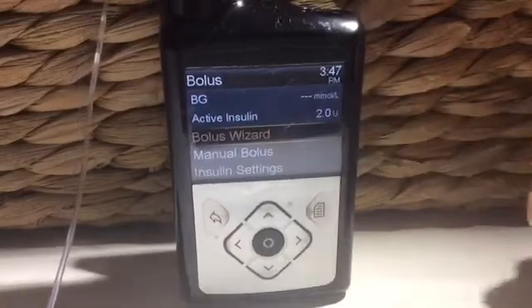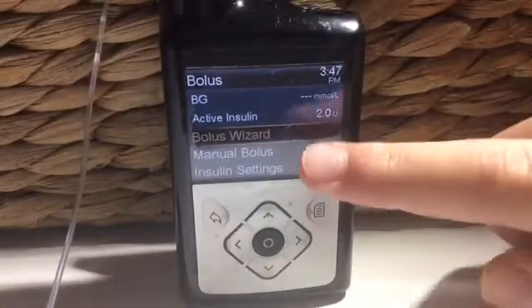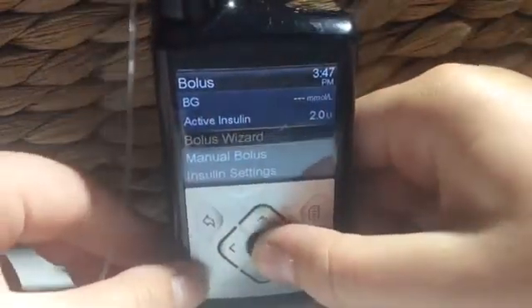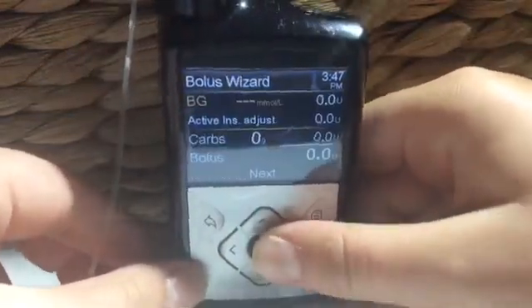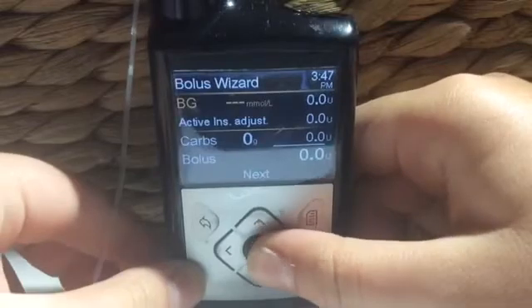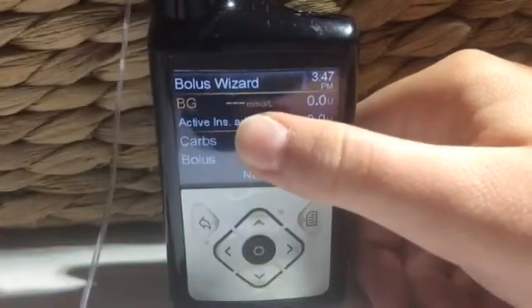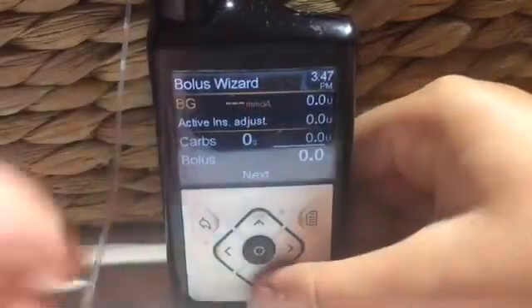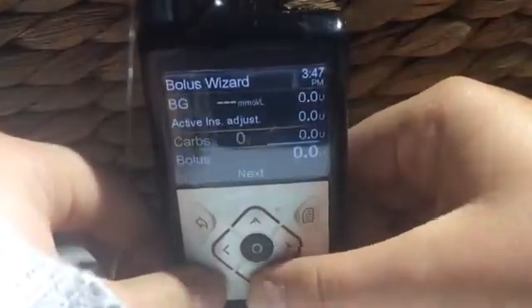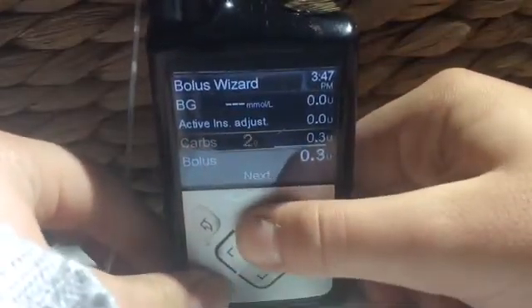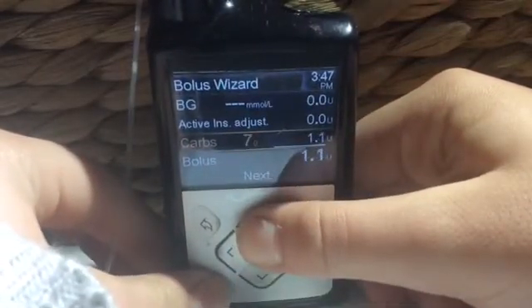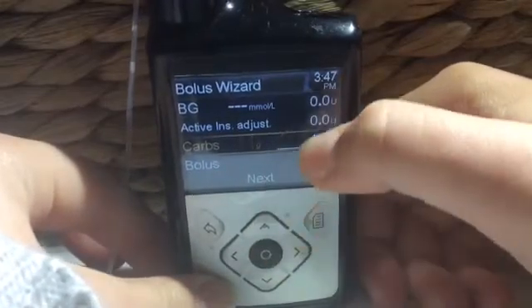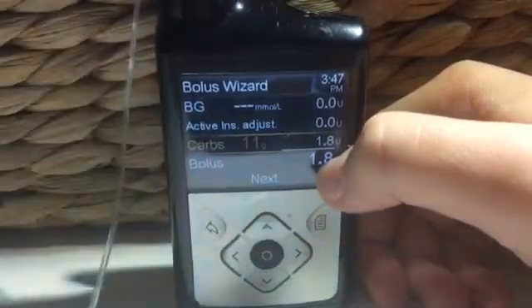So the first one is called the bolus wizard. This one is for carbohydrates, where you can enter your BGL and the carbs as you can see on the screen. For instance, if I entered say 11 carbohydrates, it will show you how much insulin you will need. This will be different for everyone, however, because we are all different.